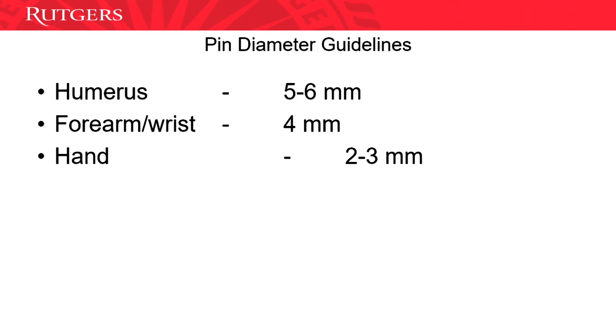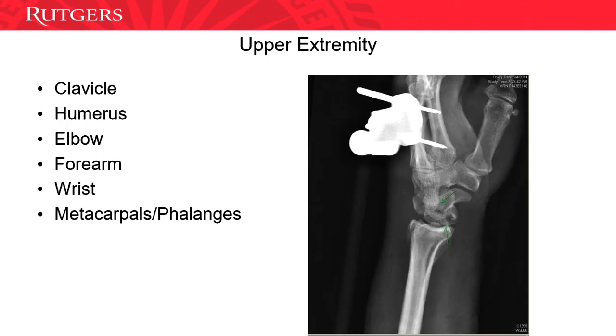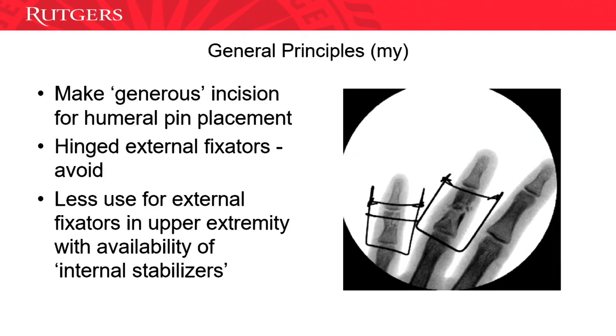Guidelines for diameter. Humerus, usually, obviously, as you go down the arm, you go for smaller and smaller pins. Just a rough idea of what you should use. And now, general principles. I only added my part because there's just one or two parts in that. Make big, large incisions in the humerus. My part would be people try to do hinge X-fixes. There might be some fans of that here. I'm not a fan of those. I don't think you get a lot out of them, and they're a real pain to put in.